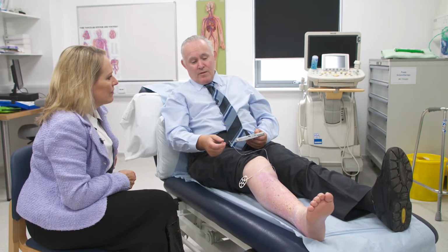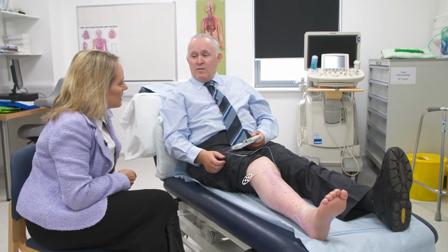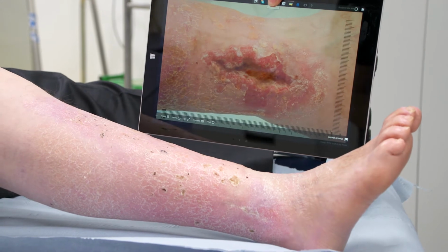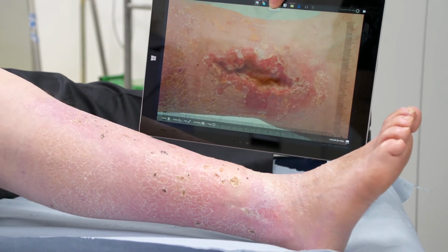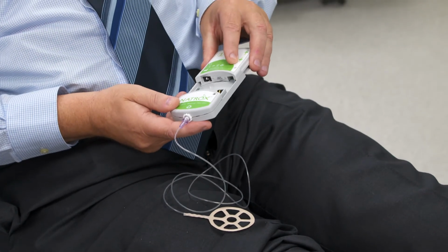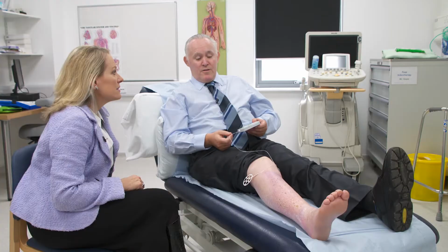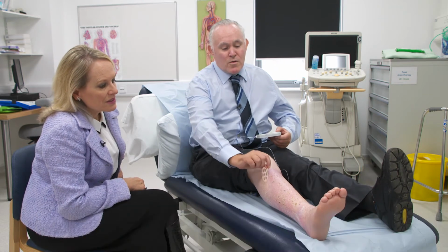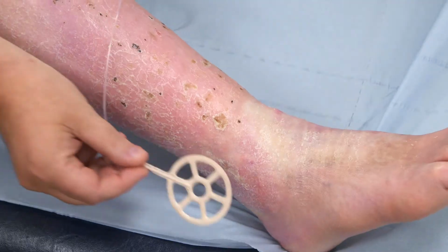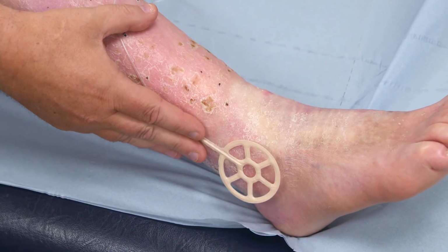Patients like Mick, who'd already lost one leg to diabetes before he began the new treatment on an ulcer that hadn't healed in a decade. Within 2 months, it was gone, and so easily, says Mick. This is a pump, and that's the battery. That is now pumping oxygen into this pipe, which goes down here to my wound. This clears up the wound, and you carry on with your life.